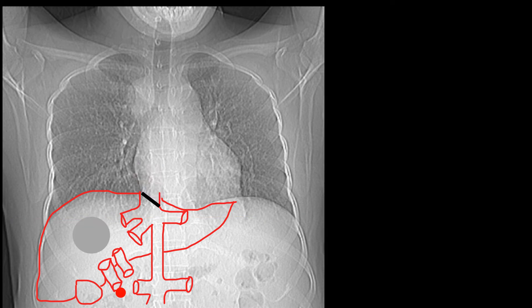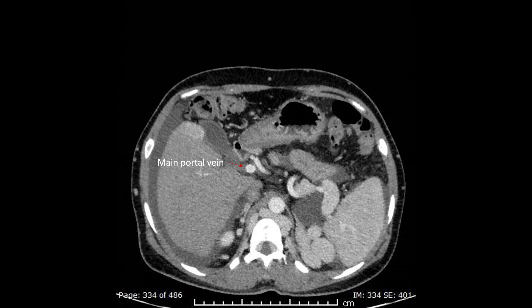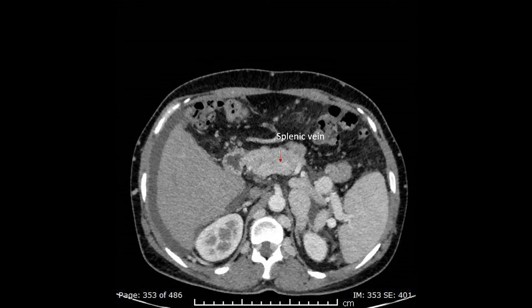The next important feature is the retrograde flow in the portal vein due to arterial-portal shunting, most of the time within benign nodules or malignant neoplasms. We recognize arterial-portal shunting on the images by the early appearance of very dense contrast agent in the portal vein. Going down, we notice that the splenic vein and its confluence with the superior mesenteric vein contain less dense contrast agent than the portal vein, which is a practical impossibility if the direction of flow in the portal vein is normal.